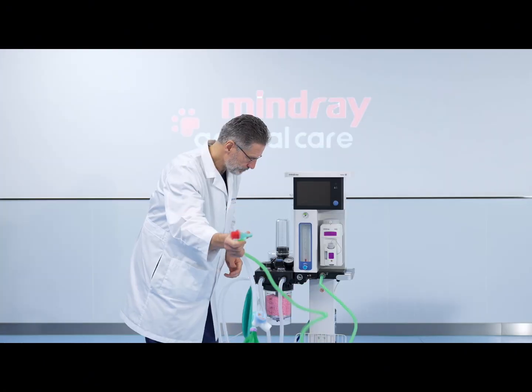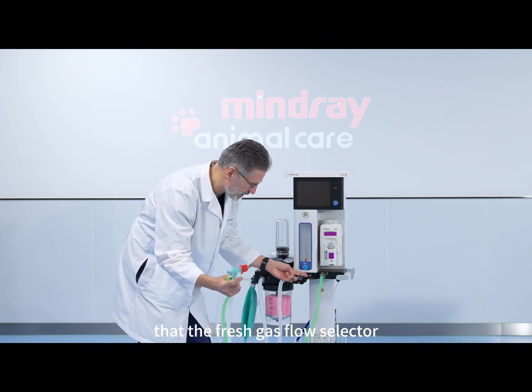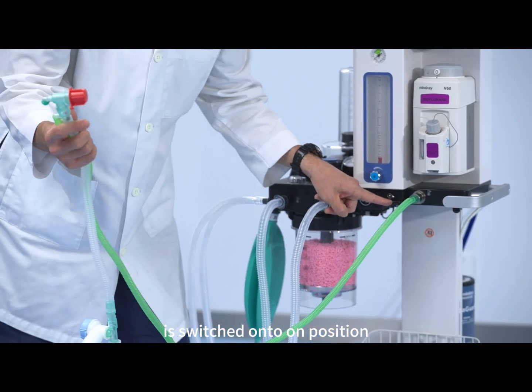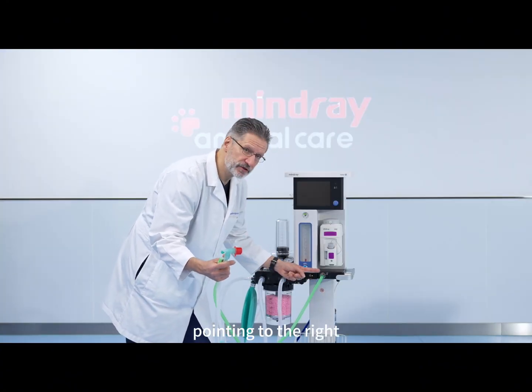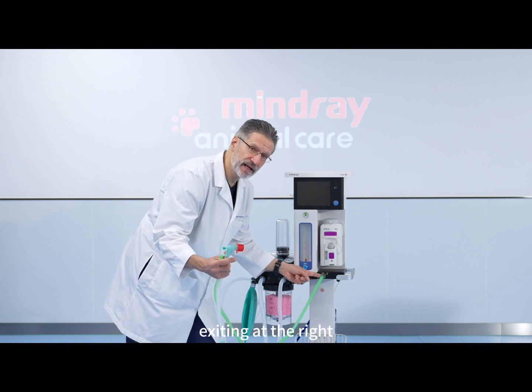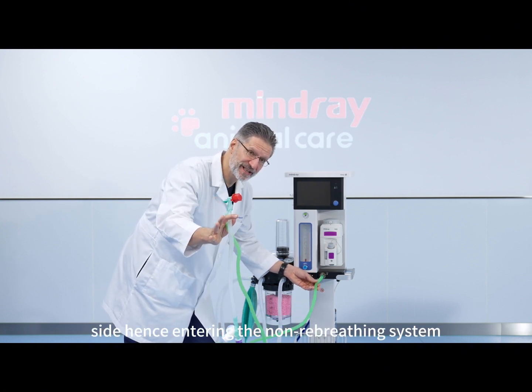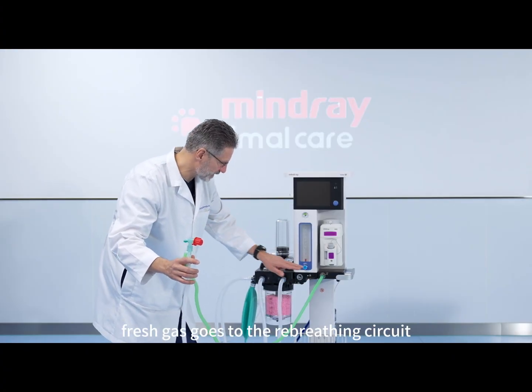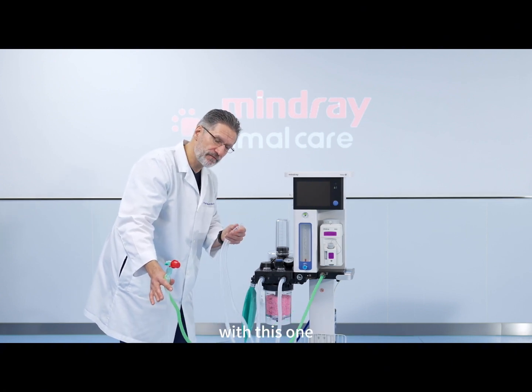So when you take your non-rebreathing system you can plug it in right here at the auxiliary common gas outlet port. But before you use it, you have to make sure that the fresh gas flow selector is switched to the on position. Remember: on position points to the right, exiting at the right side, hence entering the non-rebreathing system; or pointing to the left, fresh gas goes to the rebreathing circuit, and then you will anesthetize your patient with that one.